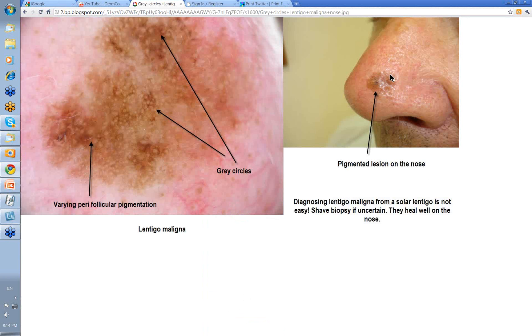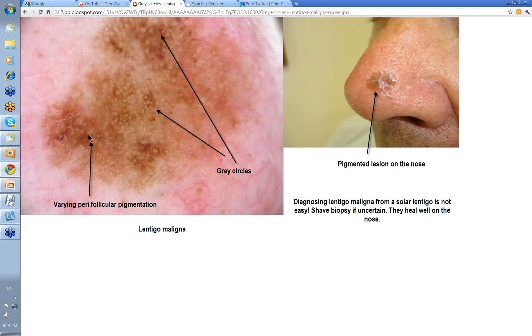Here's a pigmented lesion on this man's nose — a little bit of darker pigmentation, otherwise fairly uniform. When you put your dermatoscope on it, there's some perifollicular pigmentation in the form of gray circles here, others down here and up here. There's also some pigmentation around the follicle extending in between other follicles. When you start to see this varying perifollicular pigmentation and gray circles, it points to lentigo maligna.